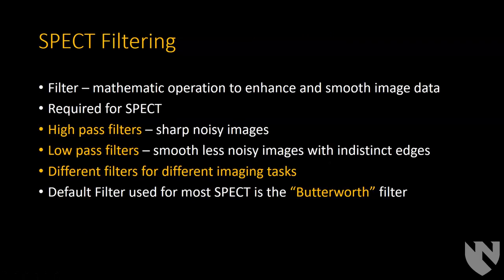If you use filtered back projection, that filtered word means that a filter was applied to it. A filter is applying some sort of math to the image to try to remove artifacts or remove noise. In general, you can group filters into high pass filters and low pass filters. A high pass filter lets high frequency stuff pass through, and a low pass filter lets low frequency stuff pass through.